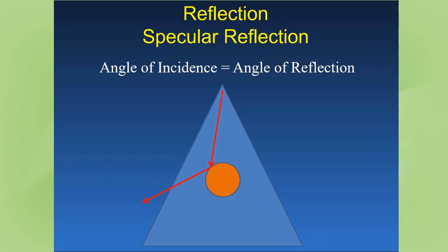The only ones we end up seeing, the only ones that are reflected, is the one that comes straight smack down onto the ball in an orthogonal way and hits that ball right on that dot. And some is transmitted and some is reflected. So the reflected dot comes back and the transducer will pick that one up. So we'll know where the face of the ball is.